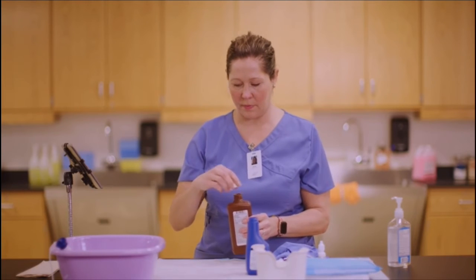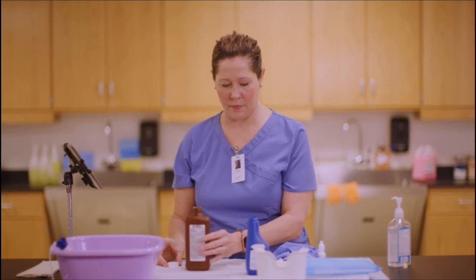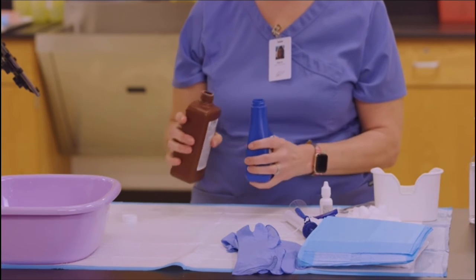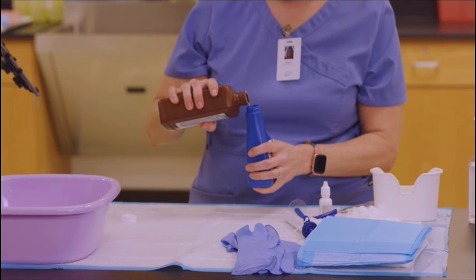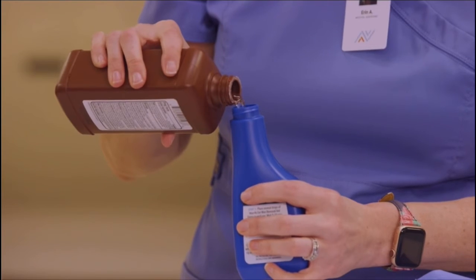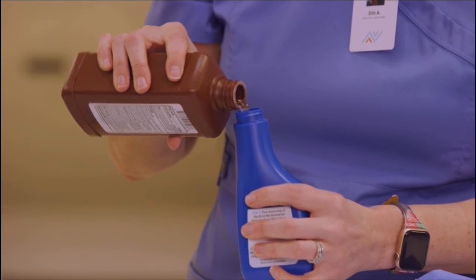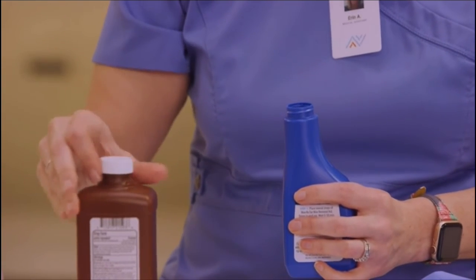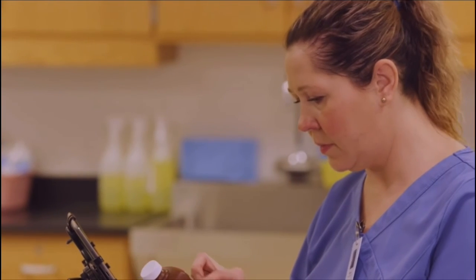Remove the cap of the solution bottle, laying it on a flat surface. Be sure not to touch the inside of the cap. Grasp the bottle with the label facing upwards. Your palm should cover the label. Pour the ordered amount of solution into the ear wash spray bottle. Recap the solution bottle and set aside if any solution is left. Confirm the correct solution for a third time against the order.